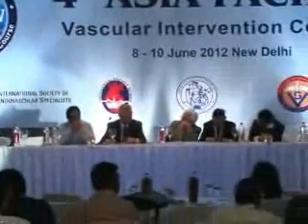What are your exact indications for a radial or brachial approach? If you compare with femoral, personally, I have done 1,200 procedures. I have used radial or brachial approach maybe in 10 cases, because by femoral approach we can do everything. And if you have a problem, the problem is not the way. It's easy to do radial brachial. The problem is when you have a complication. If you had, for example, an arterial rupture, you have to place a cover stent.